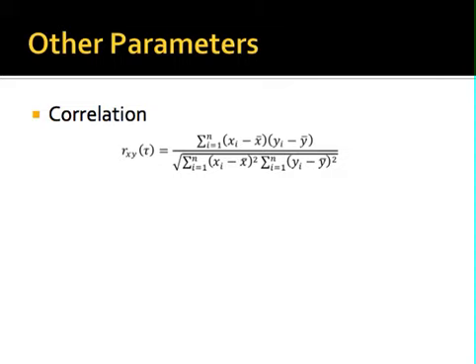And if they are correlated, it's usually because there is some artifactual or characteristic noise signal, like the pickup of 60 hertz noise that's superimposed on the EEG. And so when you get high correlations, you're often seeing correlation between not the EEG but something else that is a part of your data. But this would be how you would calculate the correlation between EEG channels.